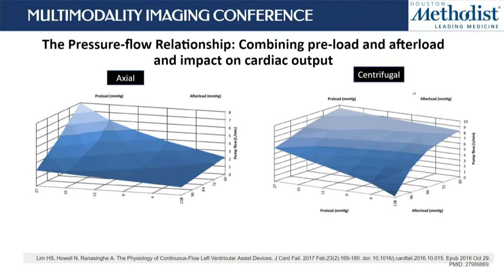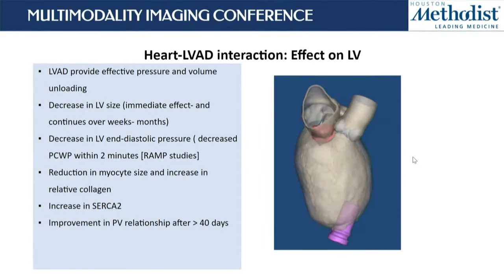This is just looking at how the technology has changed, combining preload and afterload impact on cardiac output. And if you look at the axial flow pumps, they were very sensitive to preload and afterload, but that's kind of changed, and only in extreme situations does the centrifugal flow pump get affected by preload and afterload. So what happens when we put in an LVAD? What is the effect on the LV? We're gonna talk about that first.